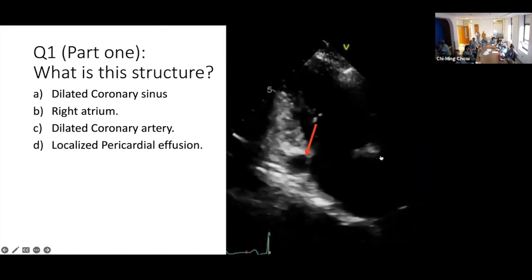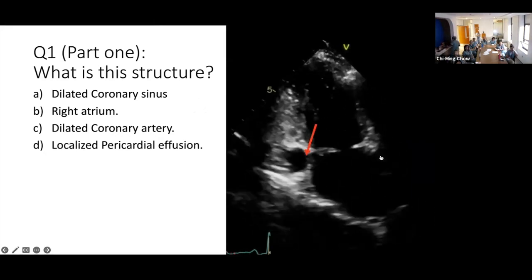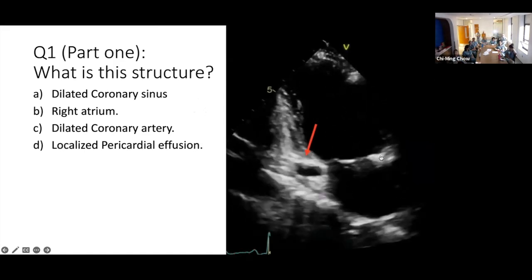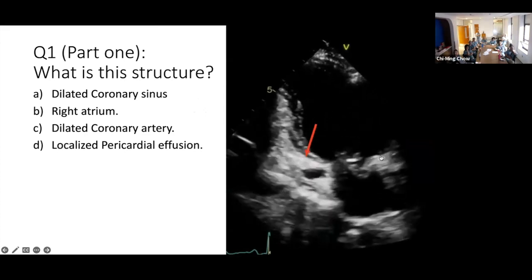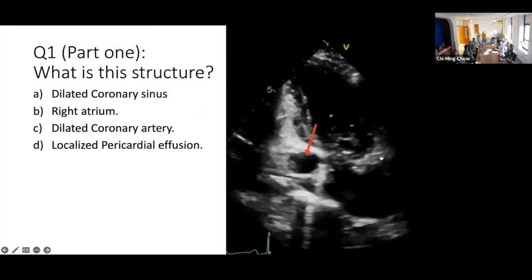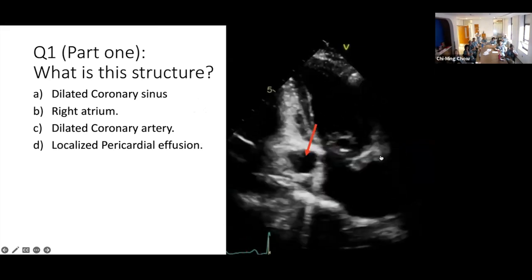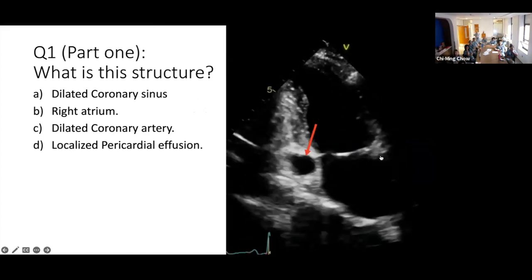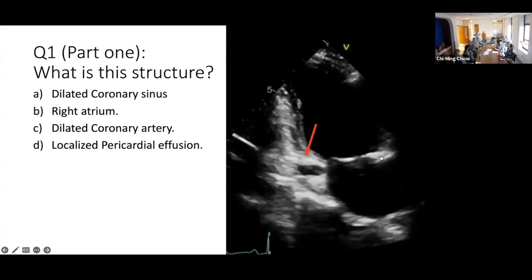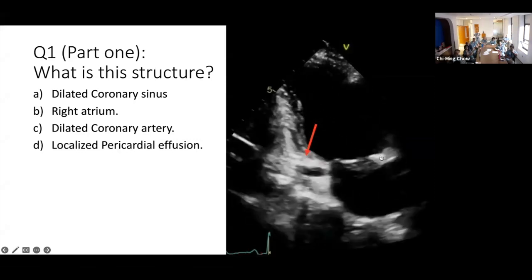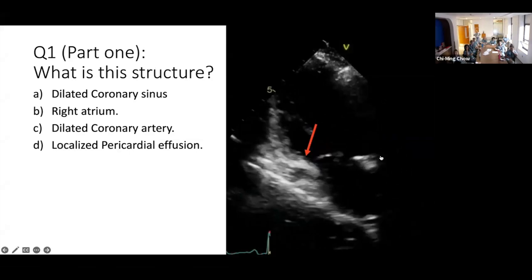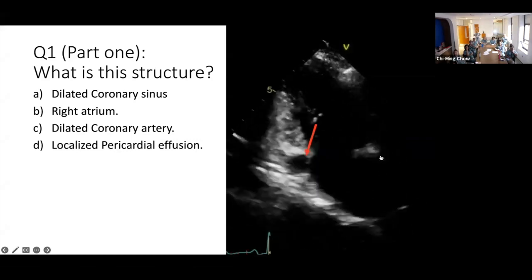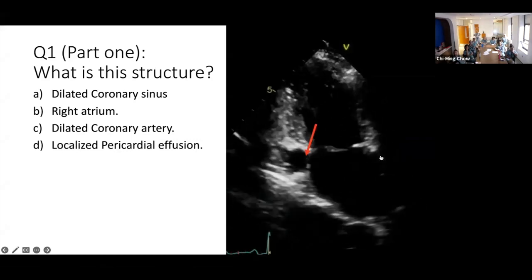So what do you think this structure is? For each question I will give about 20 to 25 seconds. So what is this structure? Is it a dilated coronary sinus? Is it right atrium? Is it a dilated coronary artery? Is it localized pericardial effusion? Okay, time is done.